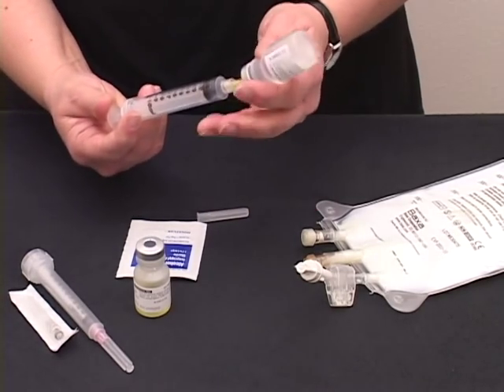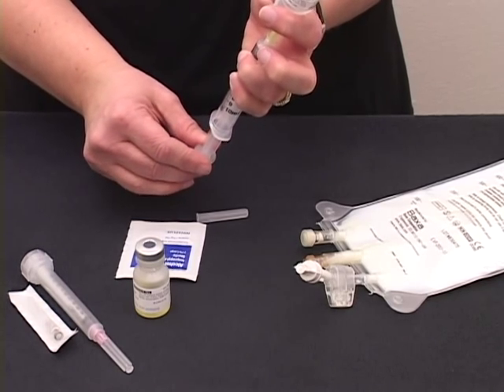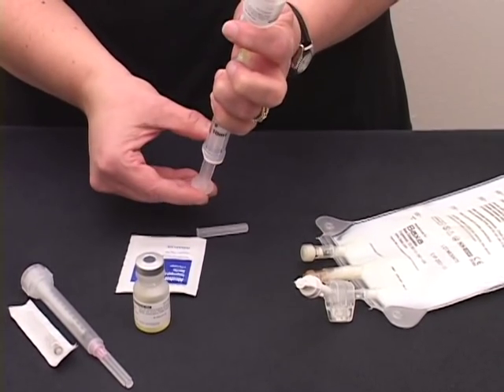Turn your vial upside down and let the fluid fill your syringe. You may need to pull back on the plunger to get the ordered amount.